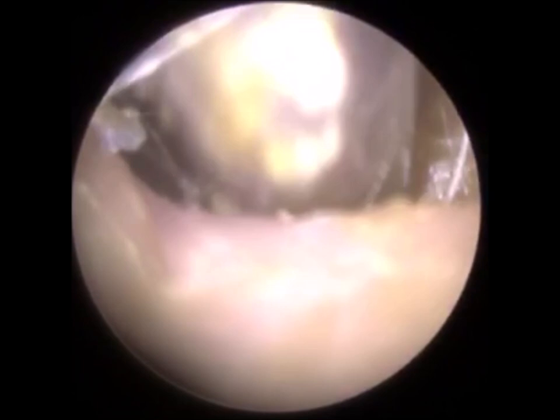So I've just got three small pieces there, and I could tell it was a bit damp. We're just approaching his eardrum there, and if you remember, the patient did alert me that he has a perforated eardrum. So again, we're going to be cautious and careful here, because we can't see the eardrum, but we know the eardrum's behind this piece of keratin that's quite medial now.